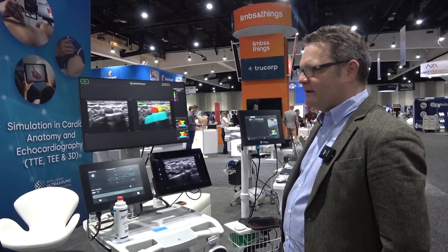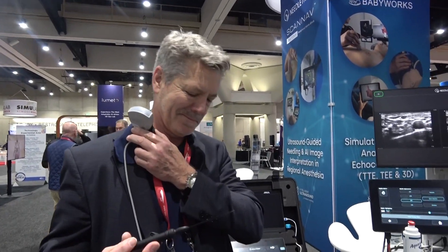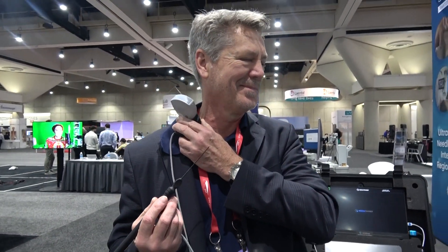So if you look at the system here — this is Gerry, by the way, who's helping me by doing the demo. He's very adroit to be able to do this one-handed on his own.